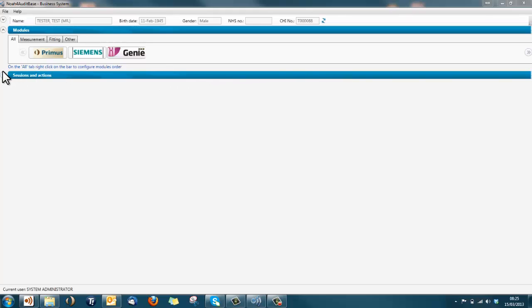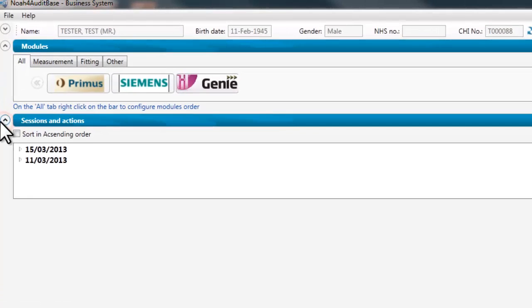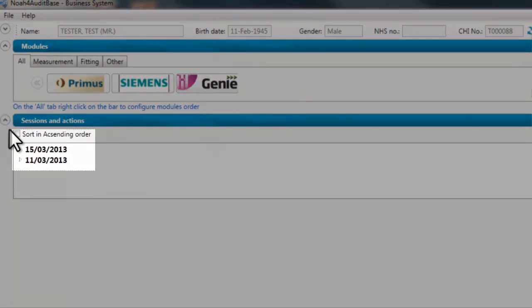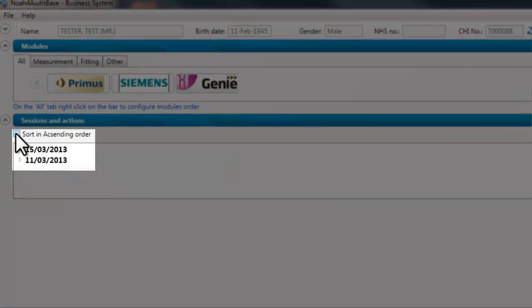When expanding the session and actions section, session dates will be displayed. These can be shown in ascending or descending order by selecting the tick box.